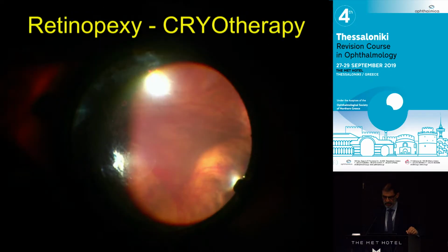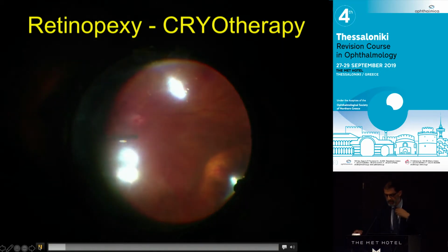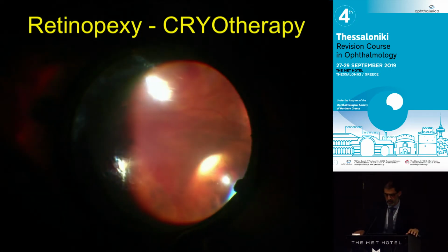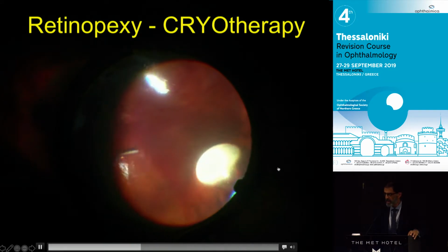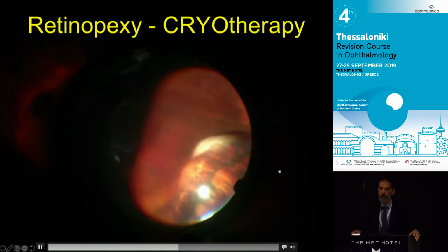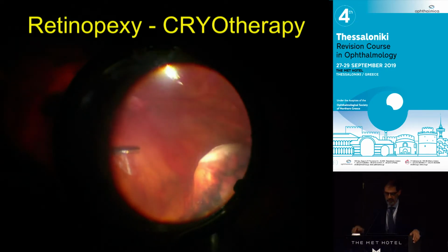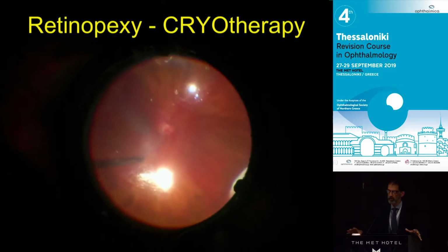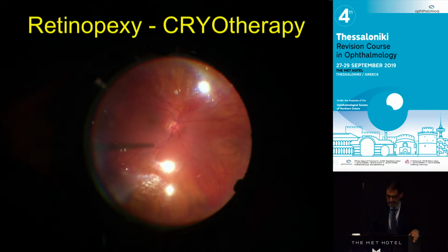Well, the sequence here, and this of course is not a scleral buckle, but it's the best way to show it, you've got to apply some sort of retinopexy, and this is just from a vitrectomy, but when you're looking through with your indirect ophthalmoscope, you can see the indentation and you can see the cryotherapy reaction. I know the DACE procedure usually says to drain, put air in, and then do the cryotherapy, but those first two steps, draining and putting air in, makes it very difficult to do the third step. So almost always I recommend to do the cryotherapy while the view is best.